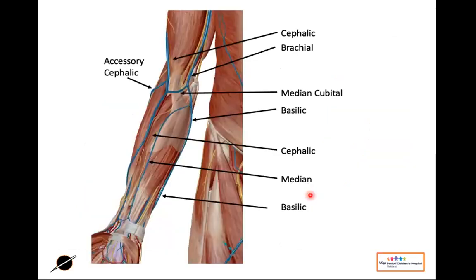So now I'm going to throw in some tissue here, to show you those veins that are running on top of the tissue. These are superficial veins, and these are our targets here. We don't want to be driving our needle through muscle tissue. We want to be shooting for those relatively shallow veins. And we can see them here.